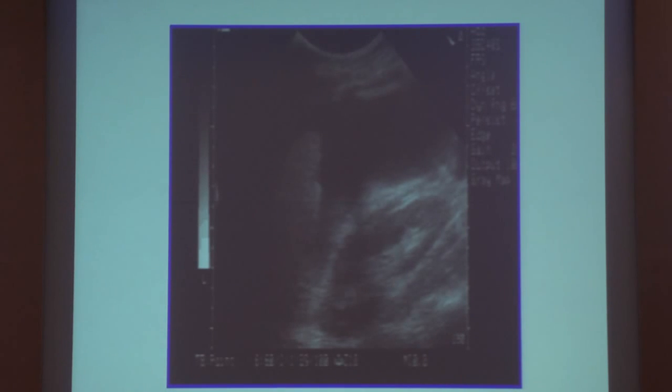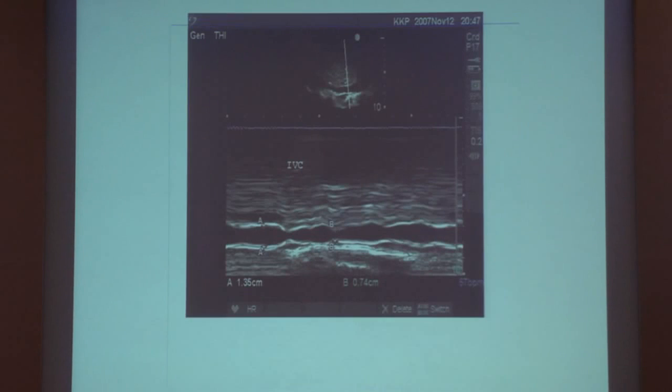And anybody who has basic ultrasonological skills can place a probe in the pelvis or in the hypochondrium to look for free fluid. In many patients, there may be intraperitoneal bleed due to a scar rupture or due to a ruptured ectopic pregnancy, for instance. And it's a pretty simple thing to identify free fluid within the peritoneal cavity using a low-frequency probe.